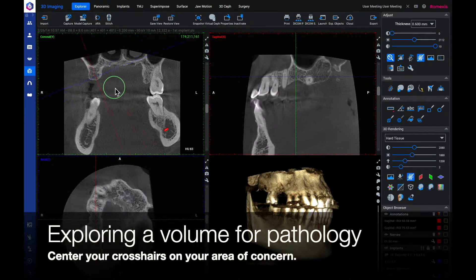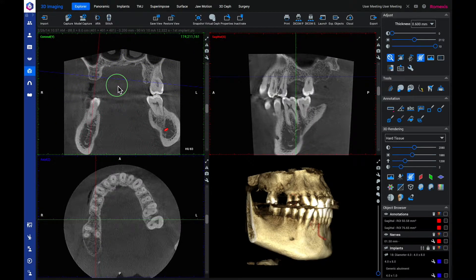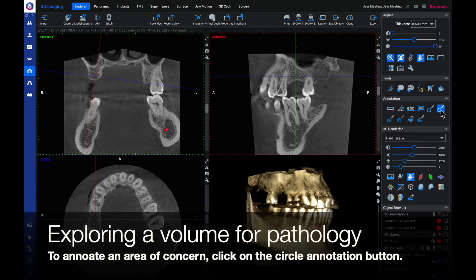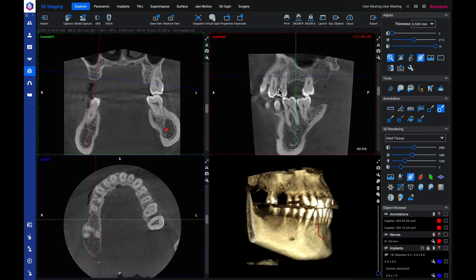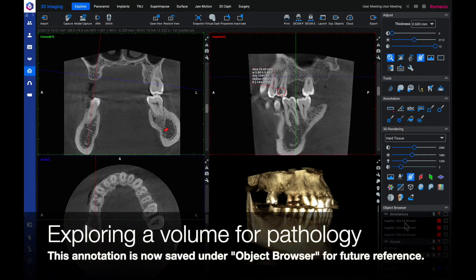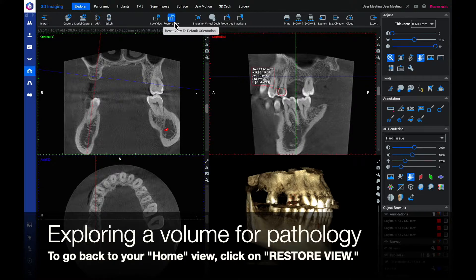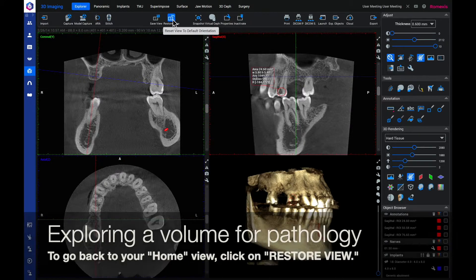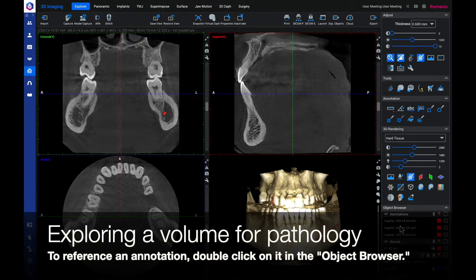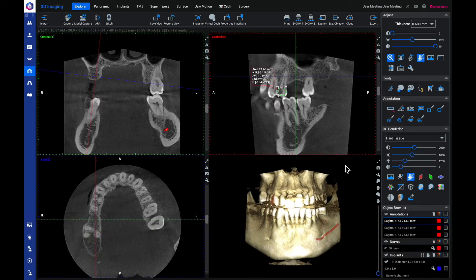Center the crosshairs to your area of concern. To annotate an area of concern, click on the circle annotation button. Drag and drop the circle into your area of concern. This annotation is now saved under your object browser for future reference. To go back to your home view, click on restore view. To reference the annotation, double click on it in the object browser.